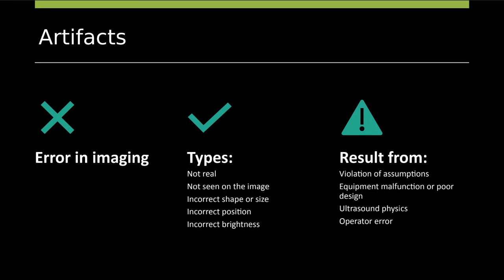So there are different types of artifacts that are mainly created from either a violation of those principles, or there's some type of operator error, or there's some type of physics error, or equipment malfunction, right? So our machine's not functioning properly.